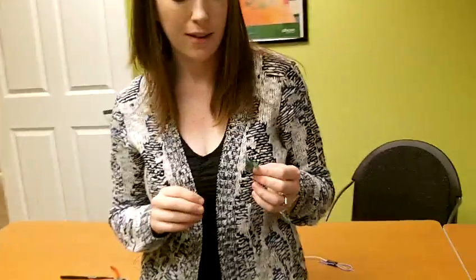So we have Jimmy rigged a listening ear mold for a hearing aid ear mold, so it's not going to be exact, but it will do for our purposes today. My lovely assistant Amy is going to help us out to do this. First I'm going to show you how to set up the Verifit to do this.